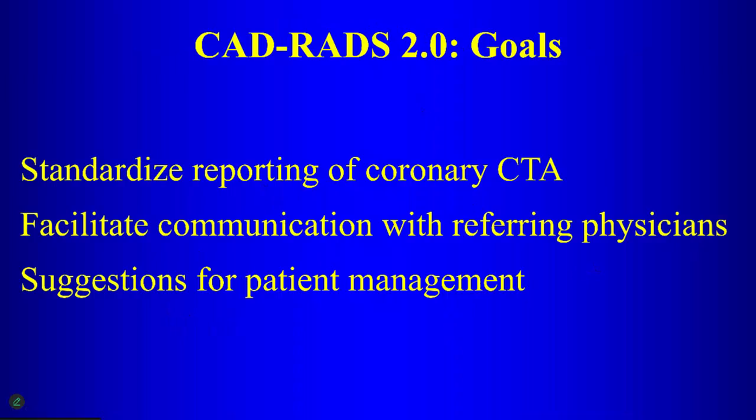I don't know if you're doing lung rads or bi-rads or even for the liver, the most important thing is the actual score. The clinician doesn't want you to describe the lesion in any great detail. They want to know what the score is because that's going to determine the management. What are you going to do next for the patient?